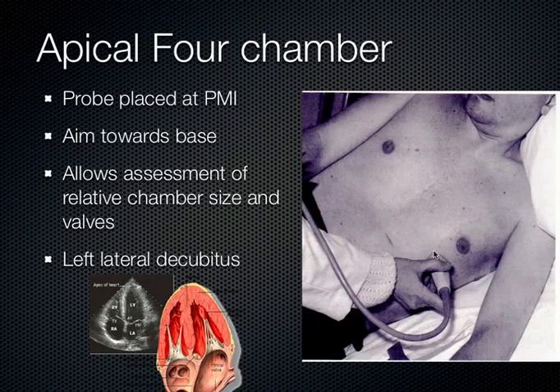Now, as this guy's laying over, I don't know if you could tell or not, but he's kind of laying off to his side. He's on his left side. So that's the position the patient really needs to be in for this apical four-chamber view. It also helps to do that for the parasternal long view as well, to tell you the truth, because that brings the heart to the chest wall a little bit better. So for either of these views, it helps to have them lay on their left side.